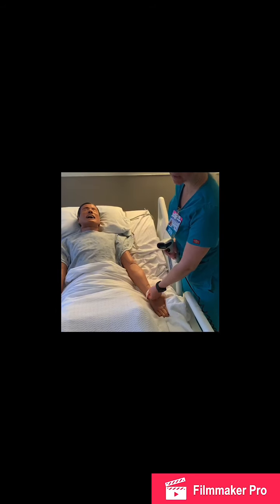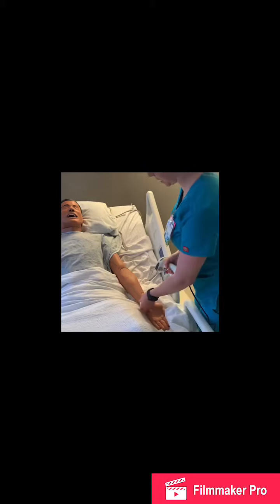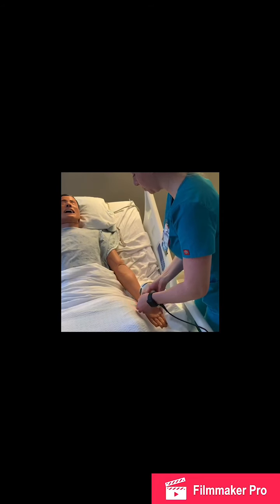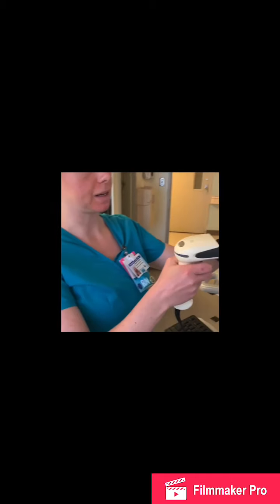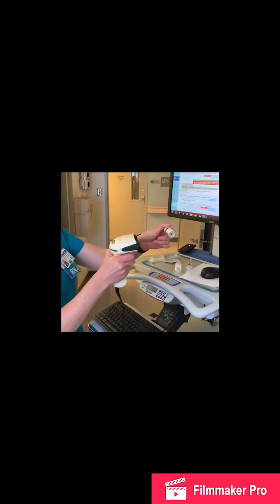He said it was Mr. Bob, and the MRN number matches my MRN number in Epic. I'm going to scan Mr. Bob's wristband. He's now scanned into the system, and then I'm going to come over here and scan my diluent, and then I'm also going to scan my medication.